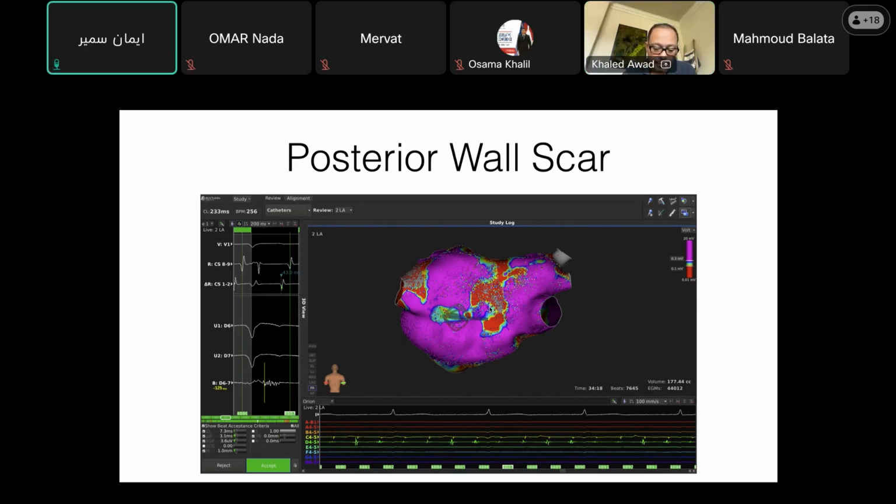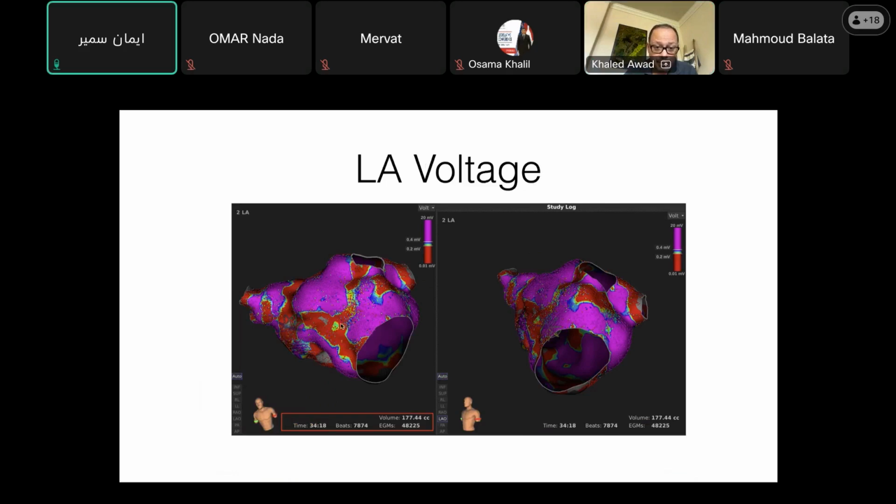Okay, and you did mention another case with a perforation in the unprotected area of the left atrium. How did it happen? It was an anterior ablation. No, the unprotected area is right here. If you were to look at this on a voltage map, it's right here, right behind the non-coronary cusp. Bachmann's bundle is sort of right here, and it's right anterior to it.